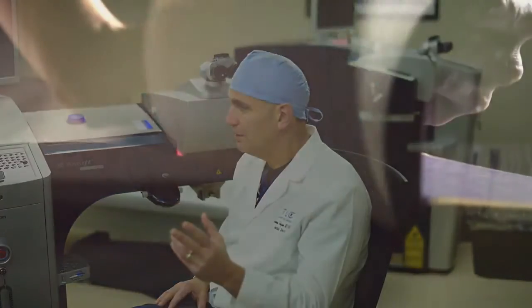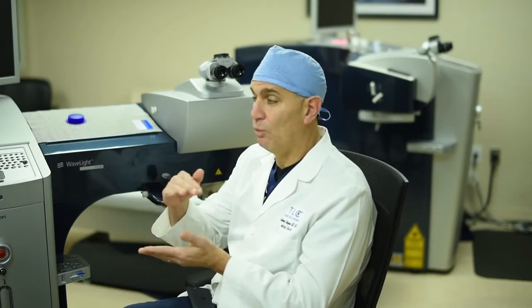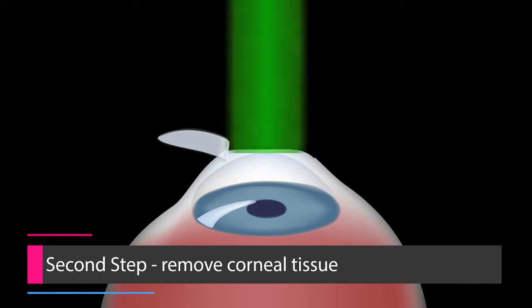The analogy I like patients to understand is: think of the cornea, or the window of the eye, as a book of 550 pages — because the average cornea is 550 microns thick, so this analogy will work. In LASIK, what we do is we open the book to page 100, so we make a 100-page-thick flap and lay it back, and then we use another laser to actually remove some of the corneal tissue, or pages of the book in this analogy.